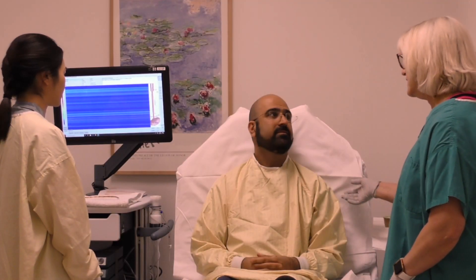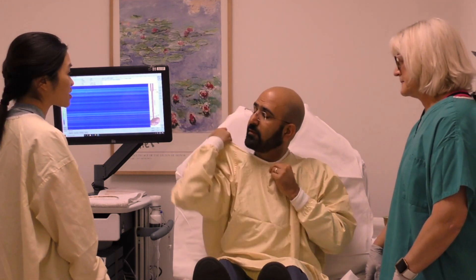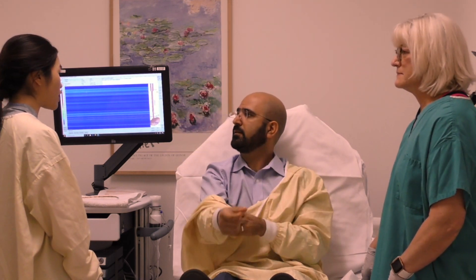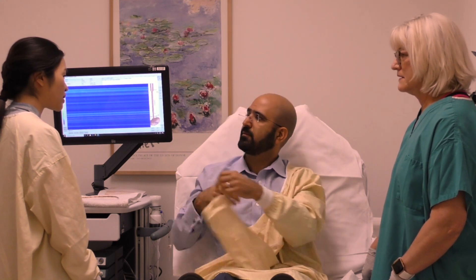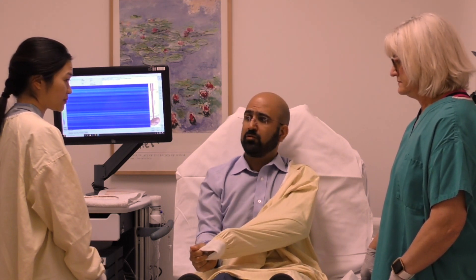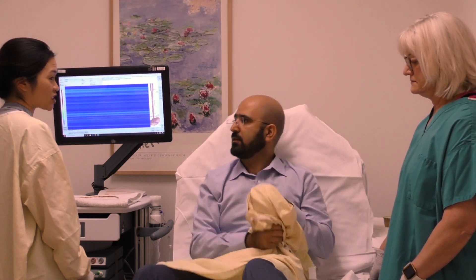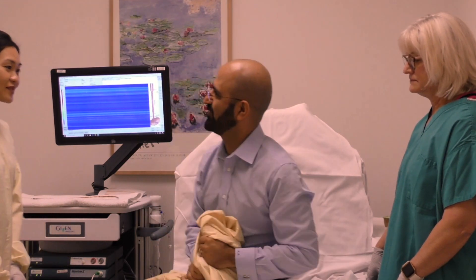Would you like help taking off your gown? No, I've got it. What do I do now? Within the next two days, we will send a copy of the manometry report to Dr. Goodman. You will talk to Dr. Goodman about the next steps. Do you have any questions? Do I do anything different — can I eat or drink? You can eat and drink and take all your medications. Okay, thank you so much.